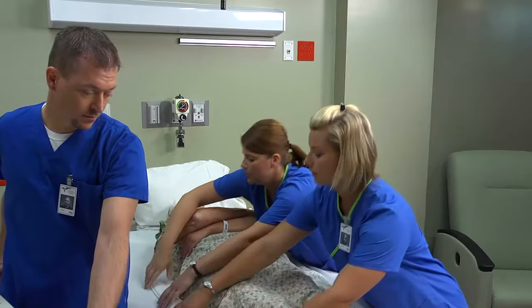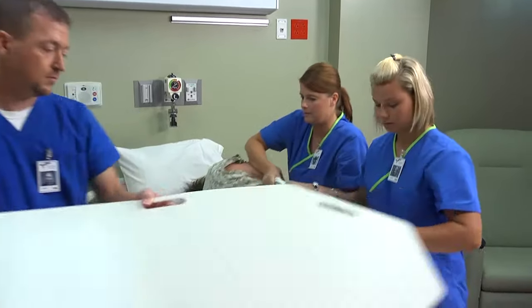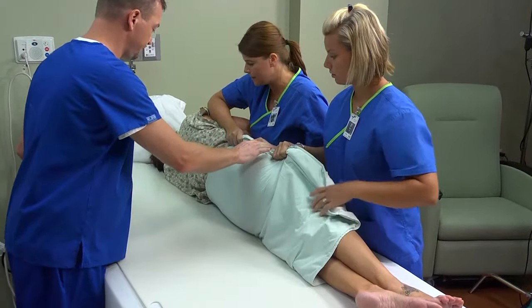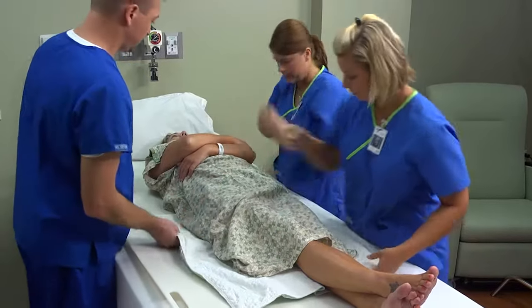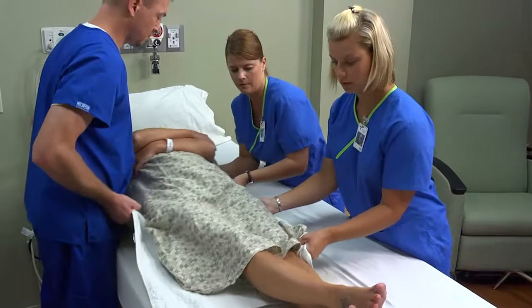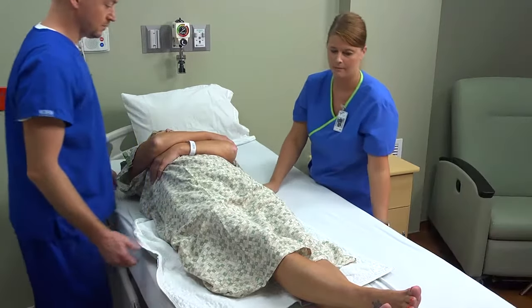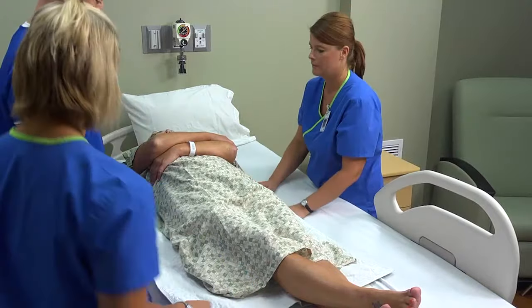On the count of three, turn the patient onto her side toward the two assistants, moving her as a unit in a smooth, continuous motion. Slip the slide board under the waterproof pad. Then gently roll the patient back onto the slide board and adjust her position to center her weight on the board.